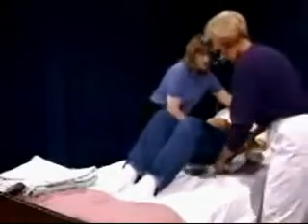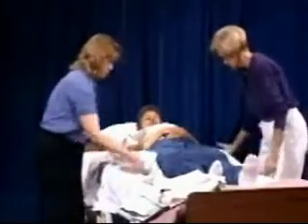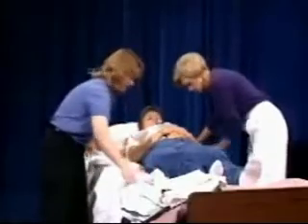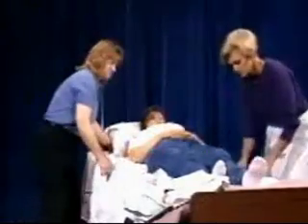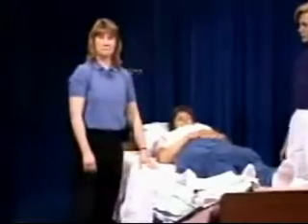We'll reposition her pillow so that she's comfortable. Make sure that you pull the draw sheet straight and flatten out any wrinkles so that she's not laying on wrinkles. And then you'd leave this draw sheet in place for future use.